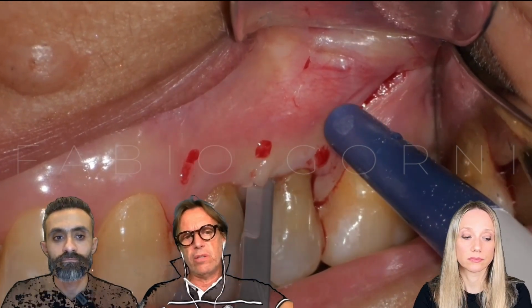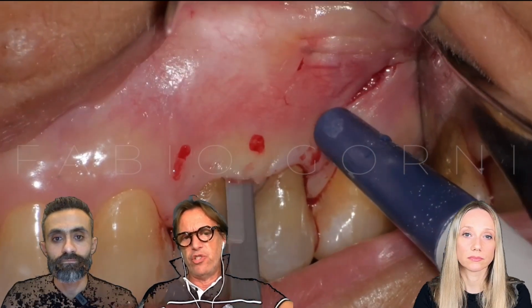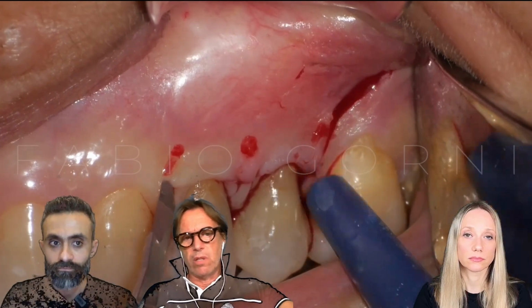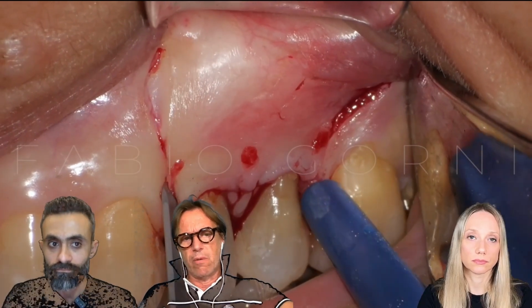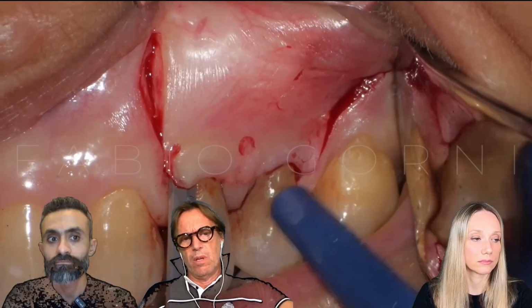The decision depends on the amount of the attached gingiva in that area. And like in this case, for example, the attached gingiva is not enough. So that's why we decided for an intrasulcular flap. In this case, it is a papilla preservation flap.